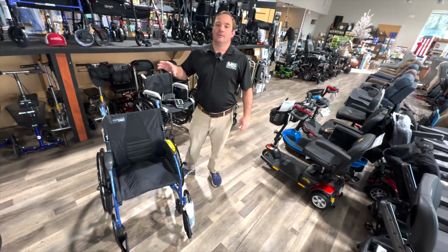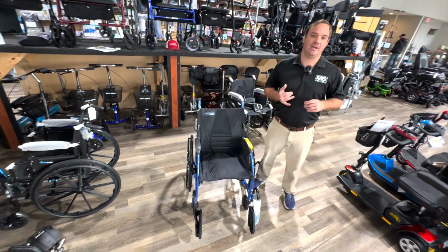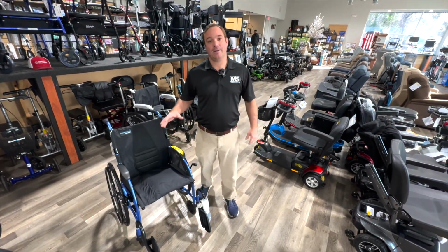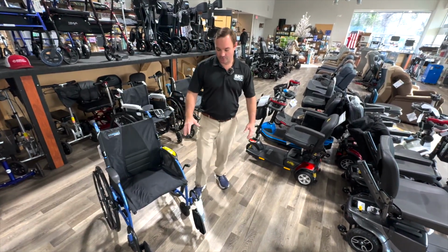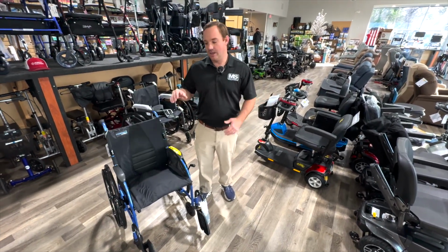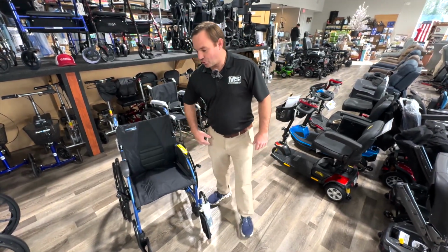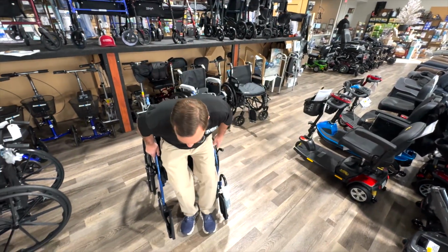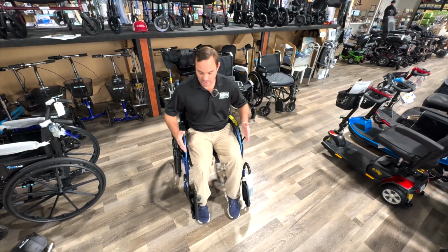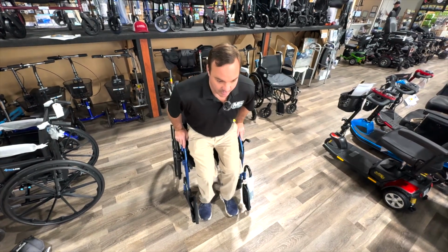But you might not want this chair if you have someone, let's say you're coming out of surgery and you have a broken leg and you need to elevate your legs. This doesn't have elevated legs. They had it, they're bringing it back to re-engineering, it doesn't. So these are standard just like this. So if you have to prop your feet up or ever need to, currently we don't have elevated leg rest. So just keep that in mind. Also, transferring out of the chair over here, there's no swing back arms. It's stationary right there. So that can be an issue for you too. So just keep that in mind when you are purchasing it.